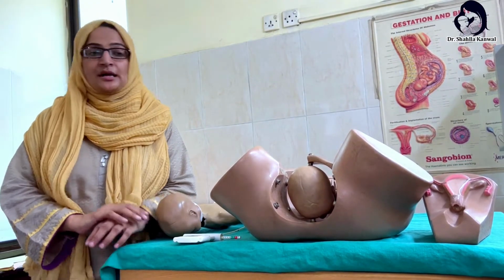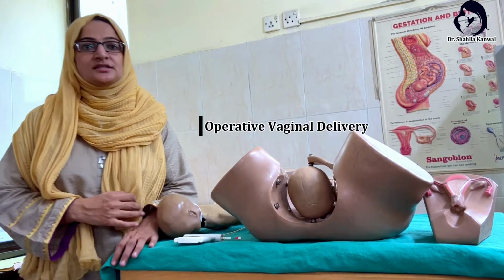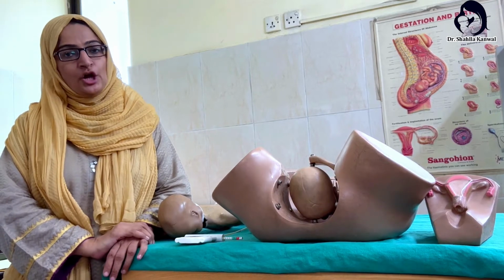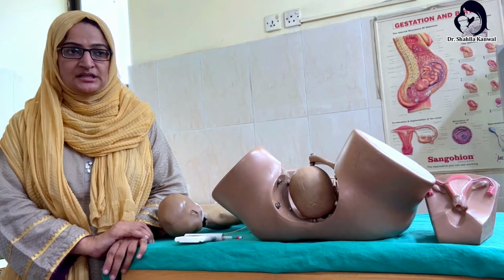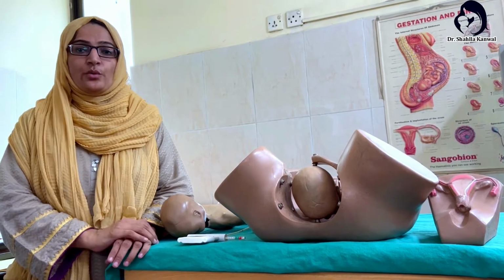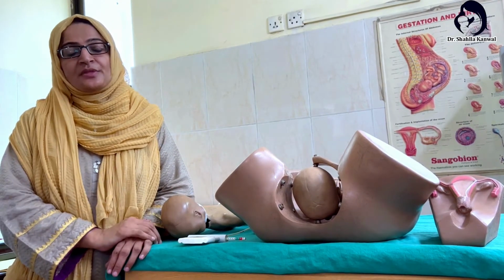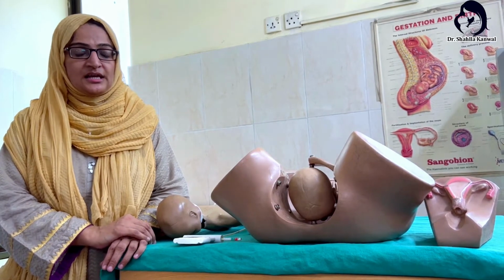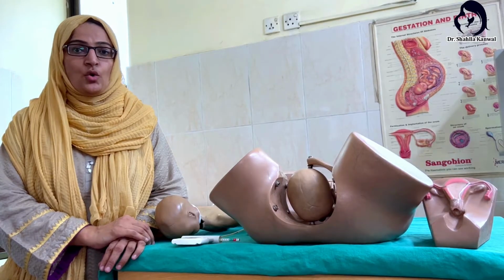So what I am going to present today is operative vaginal delivery. The incidence of operative vaginal delivery should be 10 to 15% in maternity units. 10 to 15% will decrease the cesarean section. Operative vaginal delivery includes ventouse delivery as well as forceps delivery and Omni cup delivery.